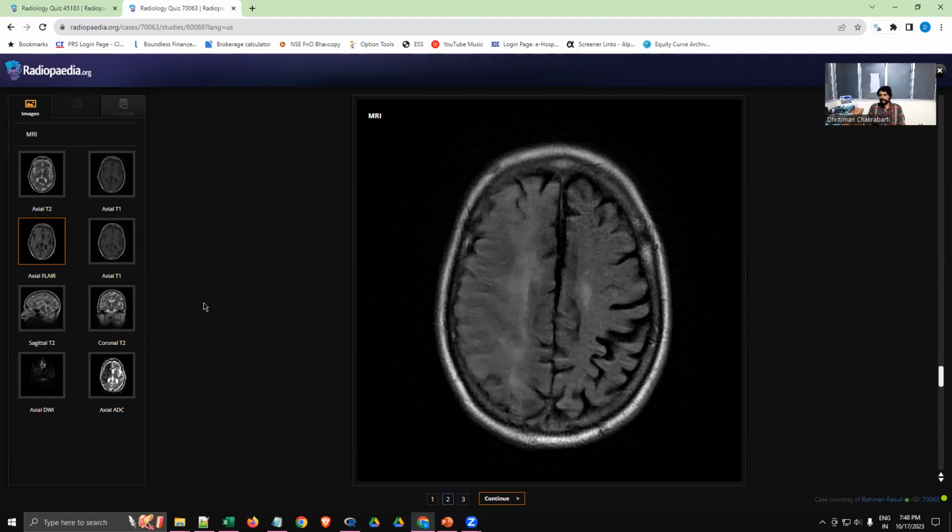So that is how your changes happen. Let me repeat it. Sorry, DWI values increase within minutes, stay constant, and in the chronic phase start reducing like this. The ADC values will be a little slower to respond than the DWI. They will become black in a span of a few hours. That is basically confirmation of an acute stroke. After that, they will start rising, and they will rise beyond the baseline towards the end of the chronic phase.